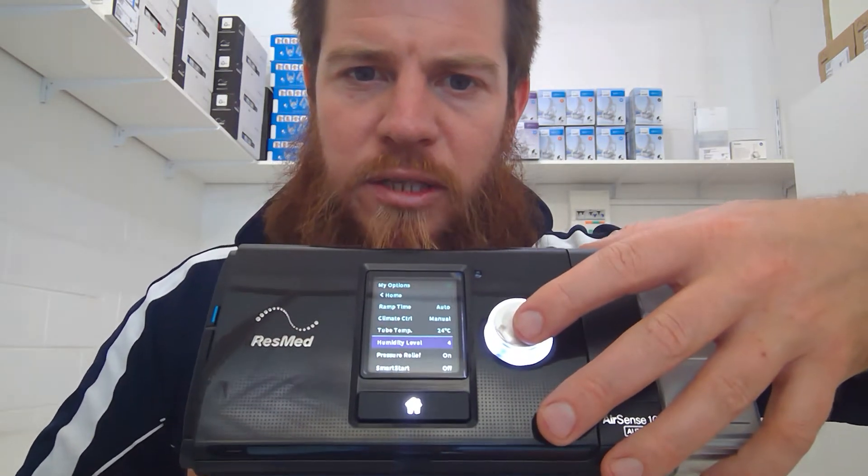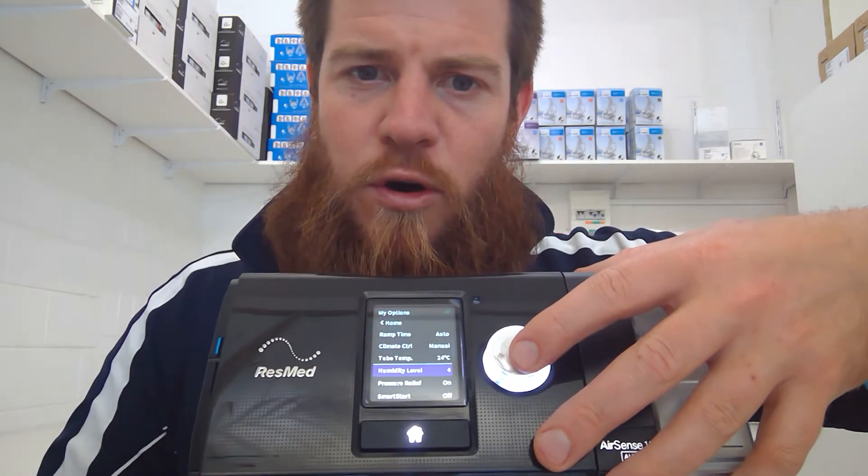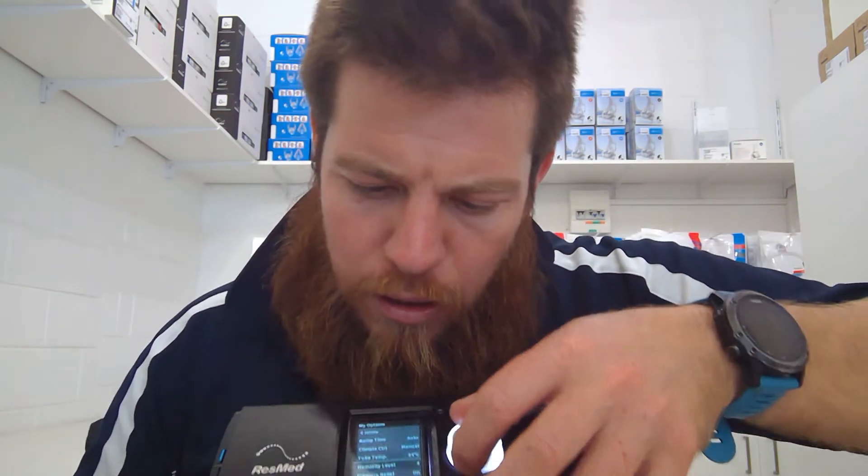Then we've got the humidity level — that's on the default setting of four. You can turn that up to get more moisture in, or turn it down to get less. So that's how you flick it over from auto-adjusting humidification to manual, and you can tweak it to what you need.